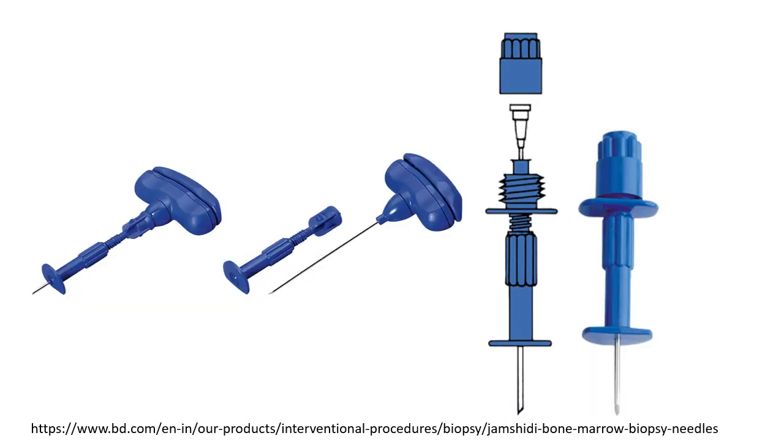This is again a Jamshidi needle. This is an Illinois Jamshidi needle. The advantage here is you can adjust the depth to which you are going to penetrate, especially if you are doing a sternal procedure in adults or in pediatrics where we need precise depth of insertion.